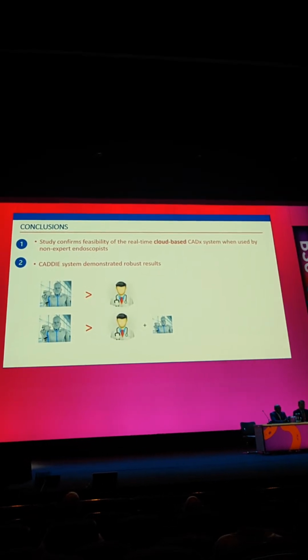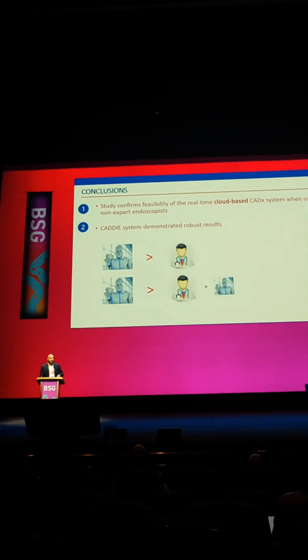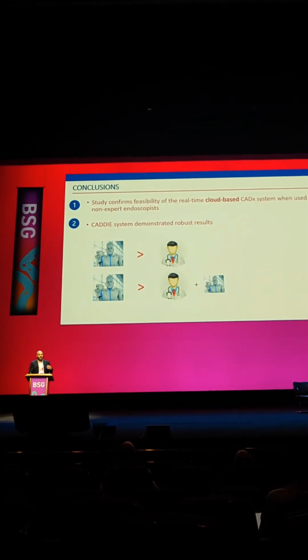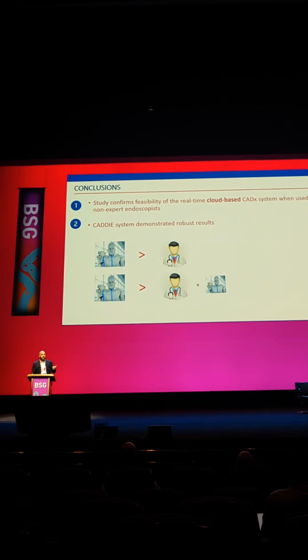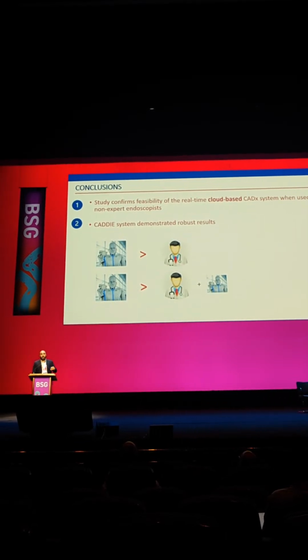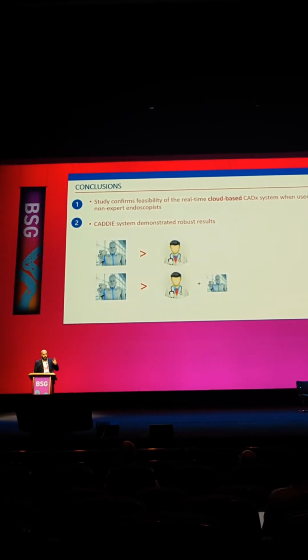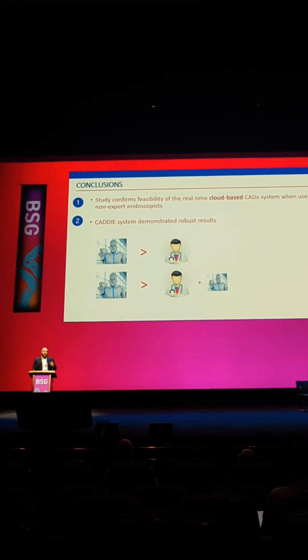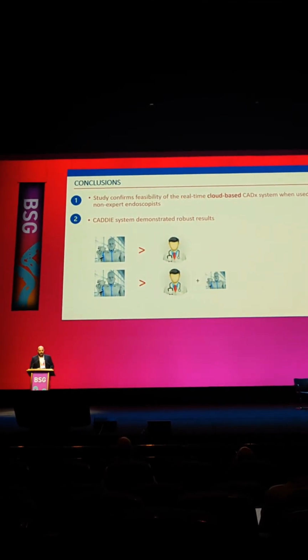There's a similar study that was recently published in Canada. That's the only other actual RCT in the field of CADx, and they had pretty much the exact same findings. When you put the human in the loop, it dropped the performance compared to the baseline autonomous AI system. And I think it's very much a research priority for us in the community to try to figure out what these complex HCI interactions are and how we can improve them.